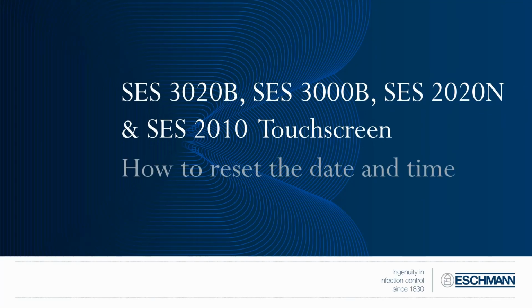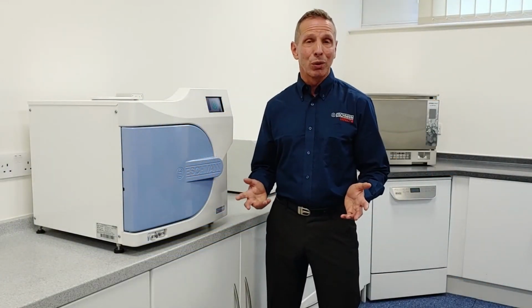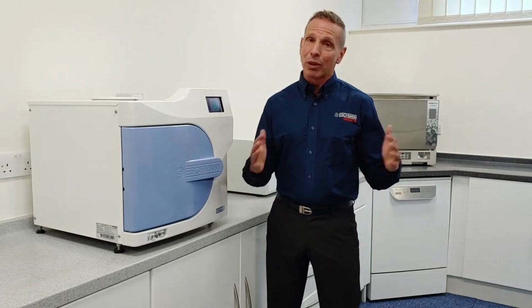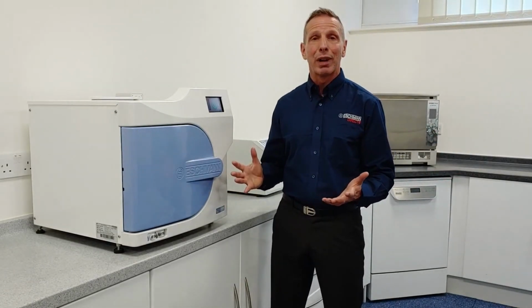Today, I'm going to show you how to reset the date and time on your SES 3000B and SES 2020N autoclaves. There are a number of occasions when you might need to reset the date and time on your autoclave. Twice a year, we put the clocks forward and back 1 hour, and you're going to need to change the date and time to reflect that.